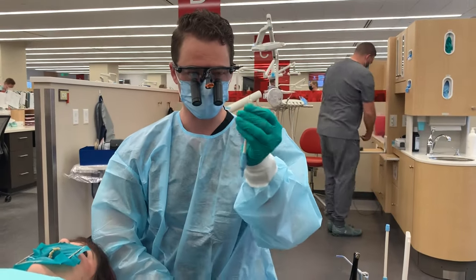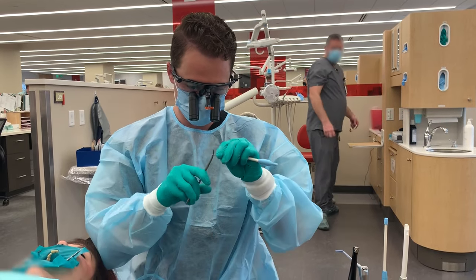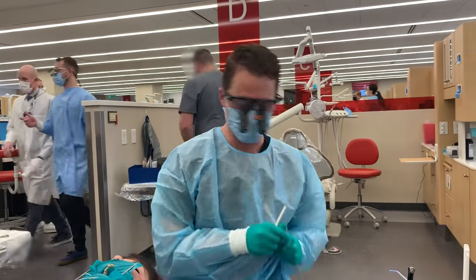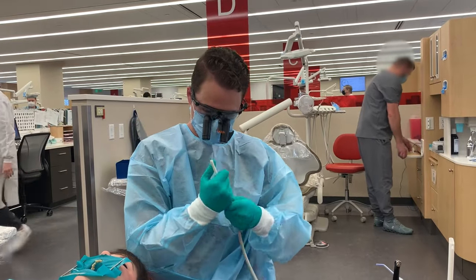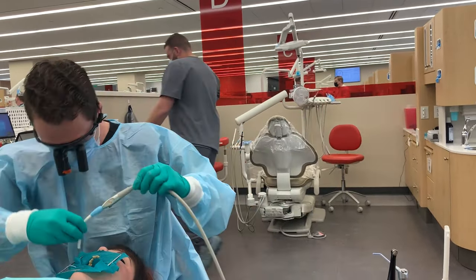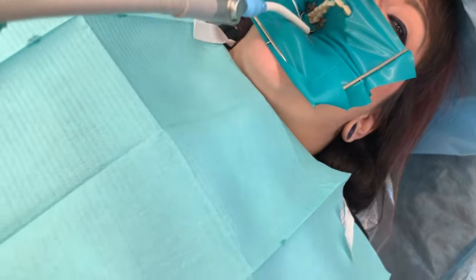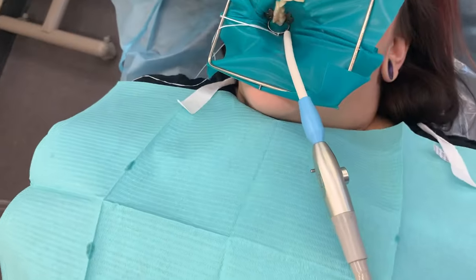The next thing I like to do with our suction is cut off the tip of it, then grab it and bend it like that. Now I have two suctions — one's a saliva ejector. Put this on and put it around our clamp. I'll have you lift up your arm and put this underneath it. And we're ready to rock and roll.